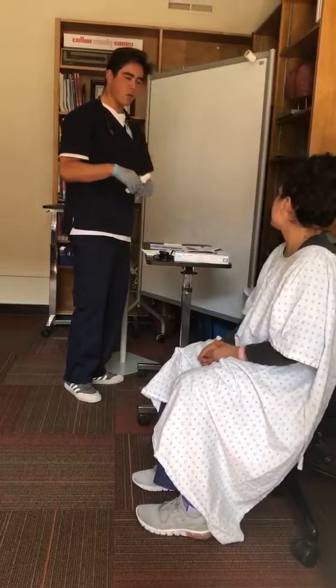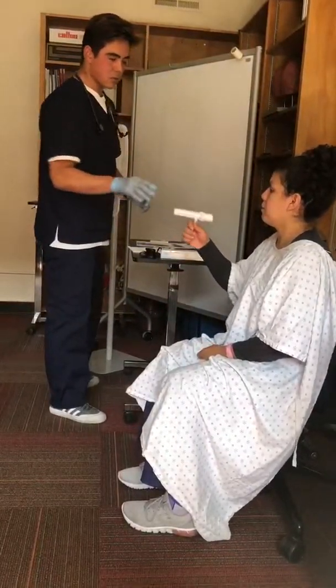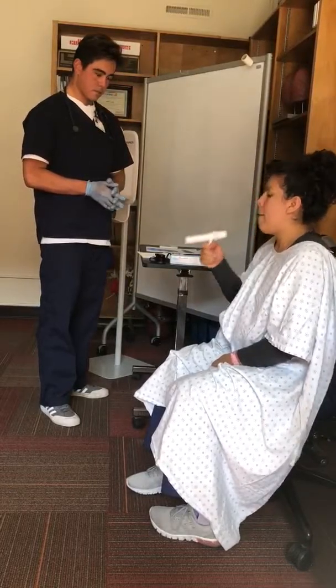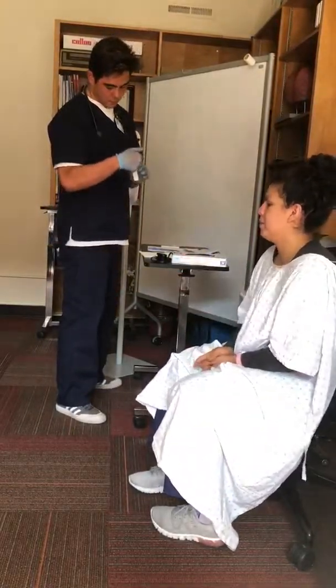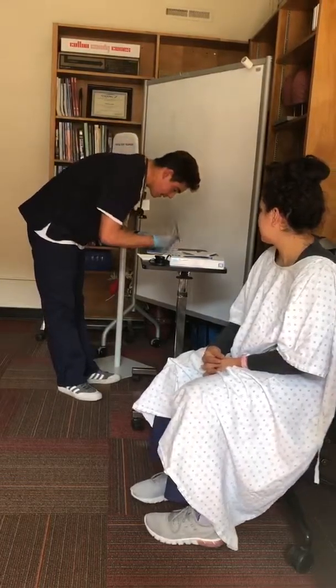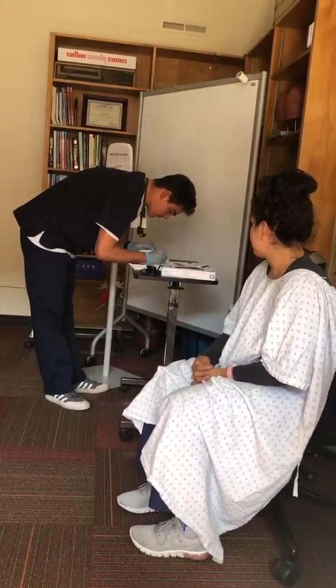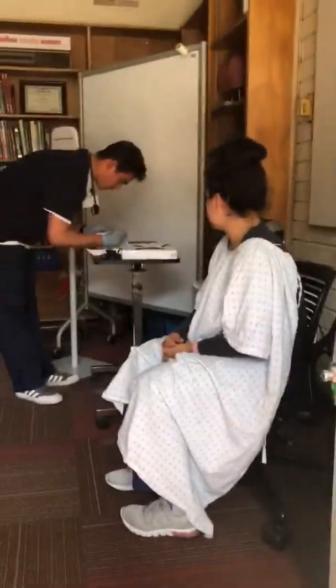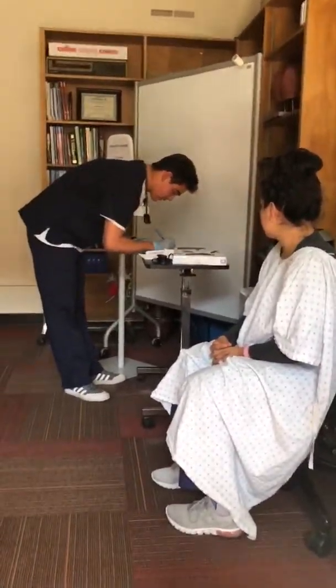So can we go ahead and have you blow one more time just to get 3 results that are within 150 ml? Perfect, good job. 400 again. Okay, so we have 410, 400, and 400. Our peak is going to be 410.